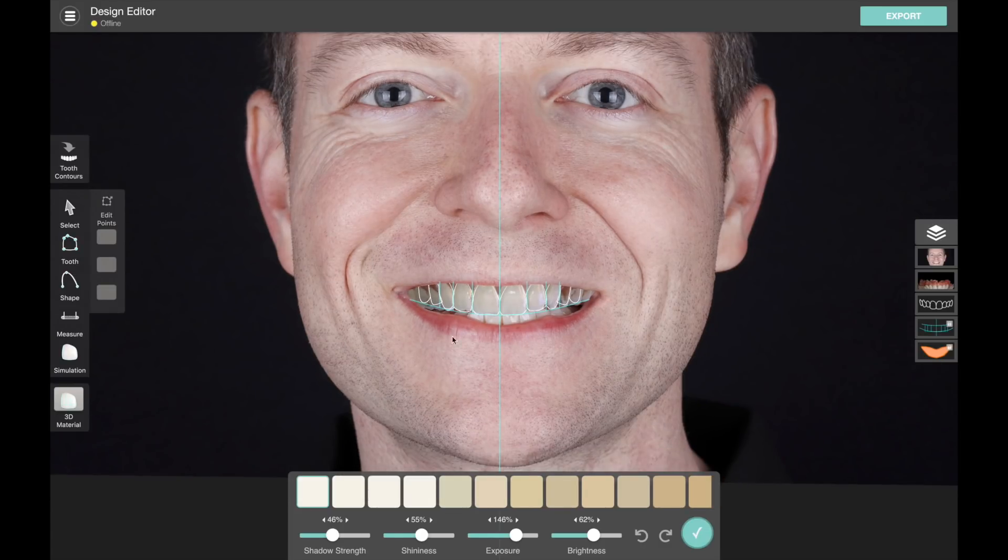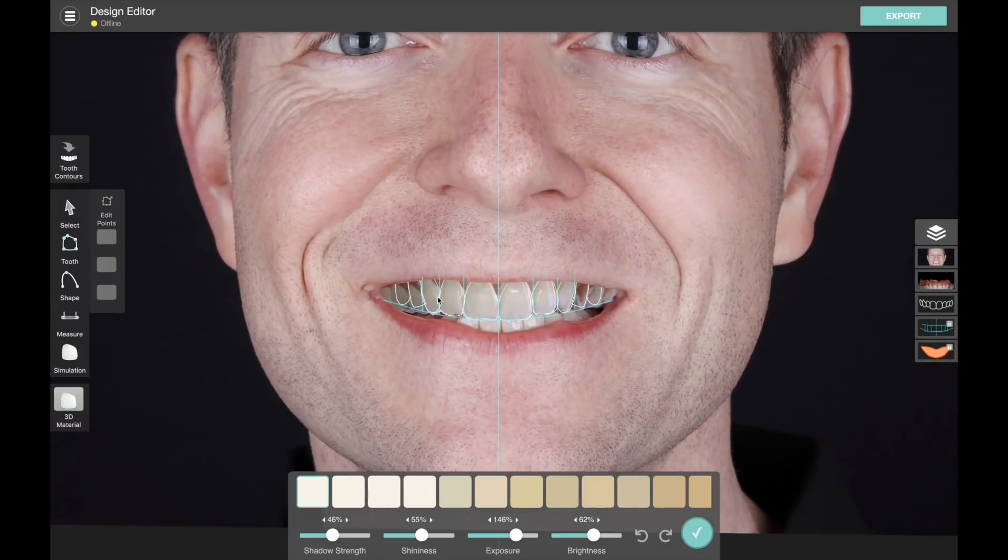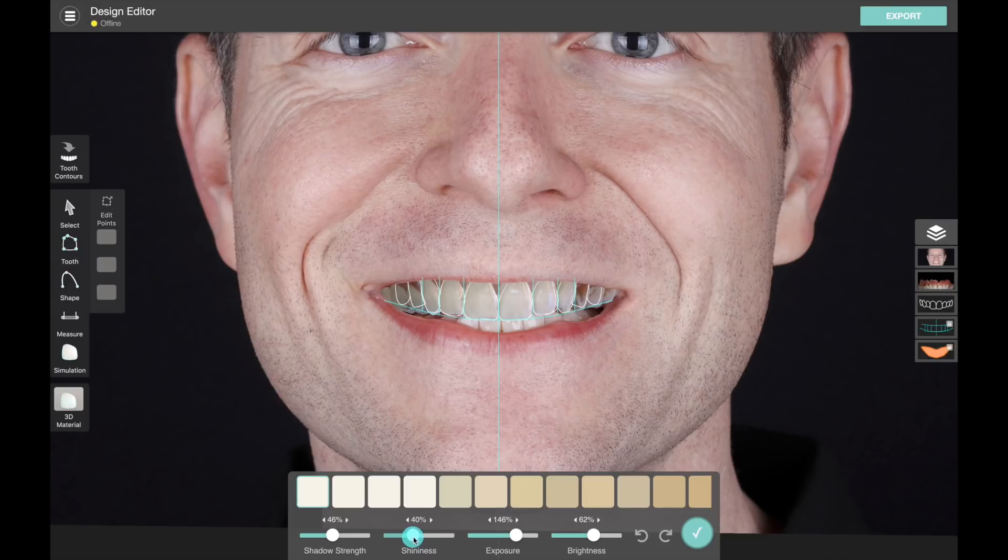In the future we'll have capabilities that go beyond just viewing 3D files, and realistic materials for our 3D teeth are really important.